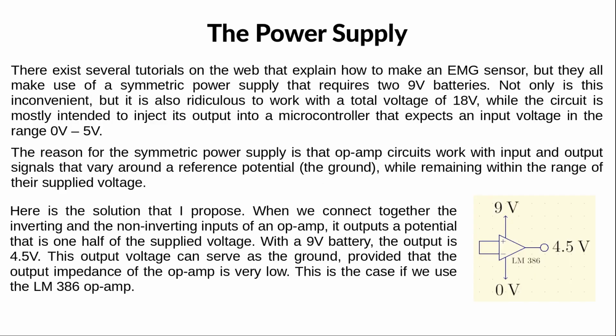The last thing that we haven't discussed yet is the power supply. If you do some searches on the web, you will find many tutorials that propose EMG sensor circuits, but they all make use of a symmetric power supply that requires two 9-volt batteries, which is not convenient. Moreover, one 9-volt battery is enough to achieve our purposes.